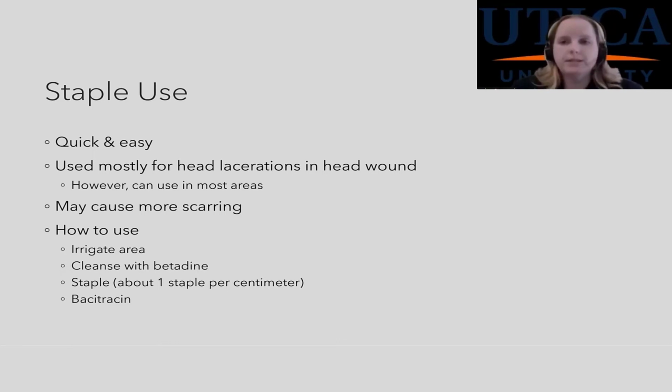Staples. So staples are very quick and easy. Okay. It's used most frequently for head lacerations. Okay. So for example, I hit my head and I have a big laceration to the back of my head. And it's very quick. You clean the area, you put some betadine on it, and then you staple, and you're done. But you can also use it in lots of other areas too. Lacerations on someone's leg or arm or anywhere. You can really use it for anything.